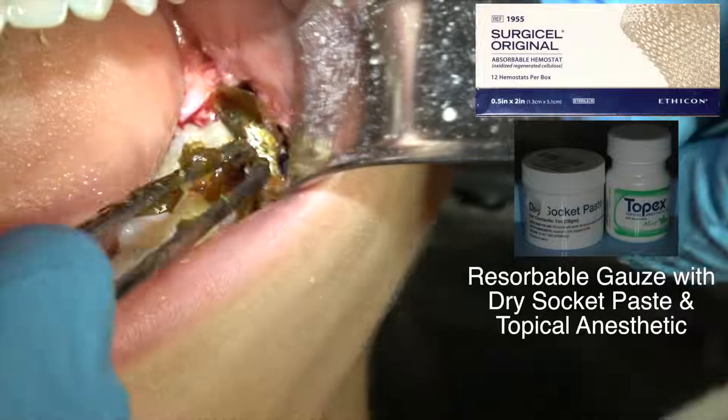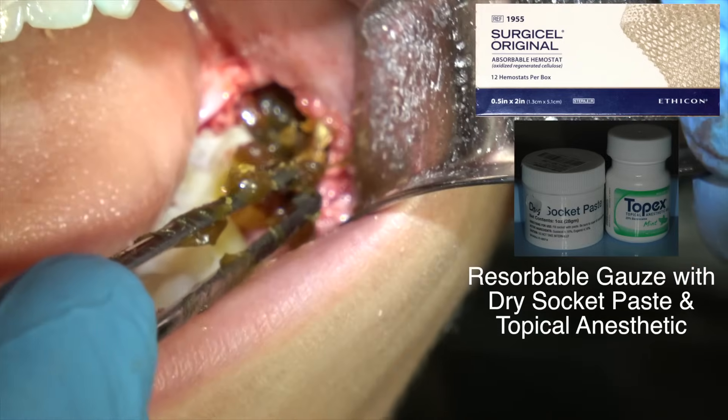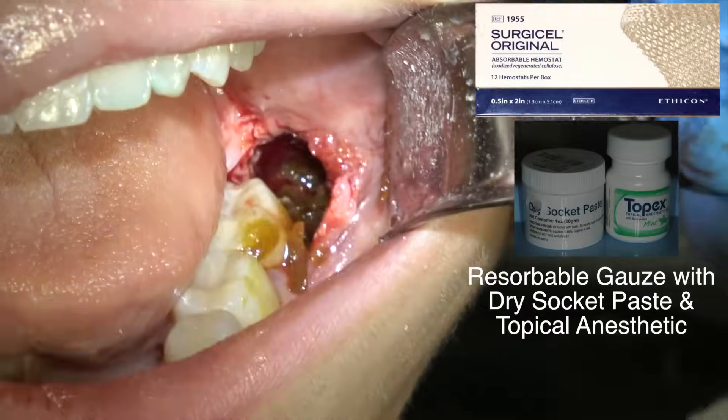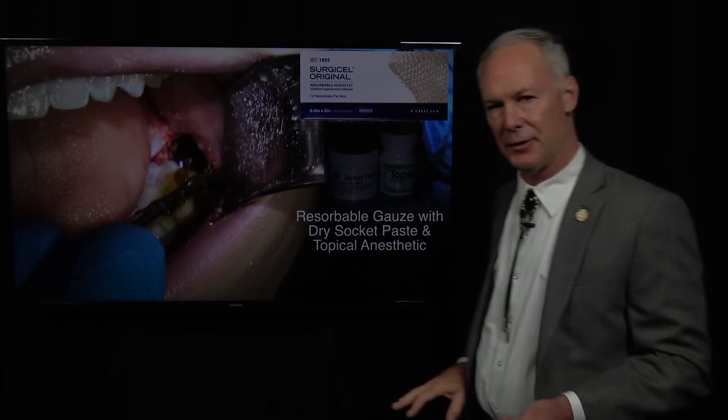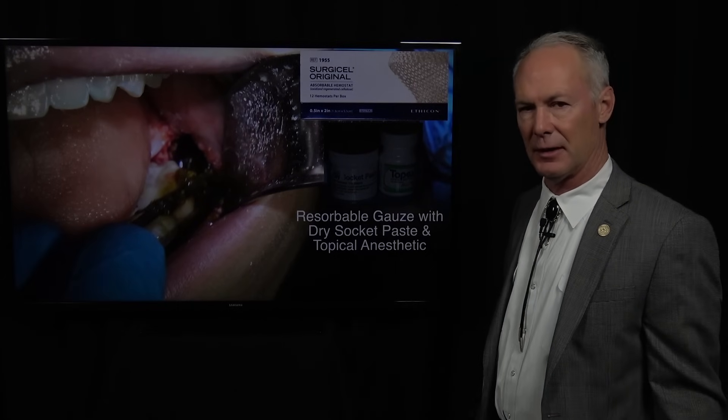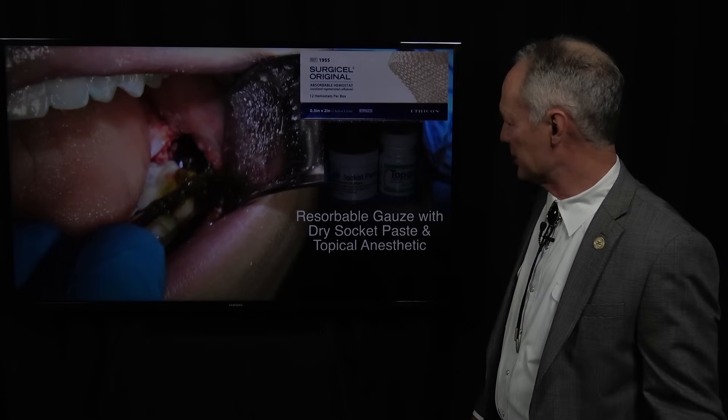I don't do it in the maxillary. I just do it in the mandibular. Maxillary wisdom teeth I never pack. Just place that in there and this is going to hold the blood clot in place so you don't get a dry socket. In 36 years of practice I've never gotten a dry socket because I do this any time I have to cut the bone with a mandibular molar extraction.